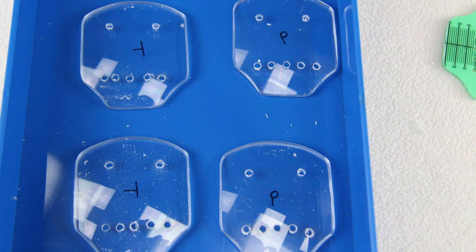Obviously, these are not going to be in the next issue of Lens Fancy magazine, but they certainly will do the job for what I need. What I really want you to take away from this is, again, just don't be scared. Try this stuff, do it, pick up some lenses, practice, play around with it, and with time, with practice, you can actually make a truly handcrafted pair of glasses.